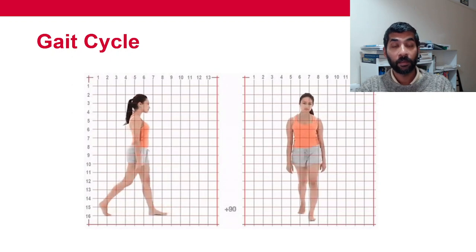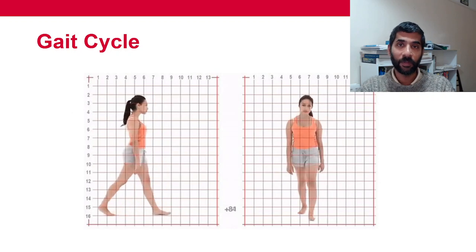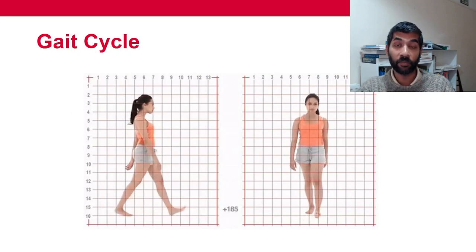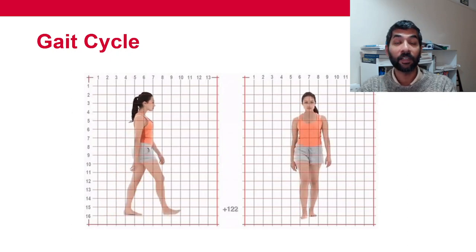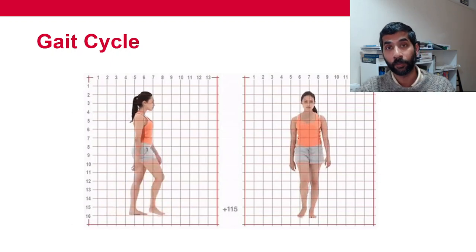But technology and recording the information and measurement of various joint angles, EMG of the muscles, will not only help the experienced clinician in making his decisions, but it will definitely help the less experienced ones in making proper decisions.